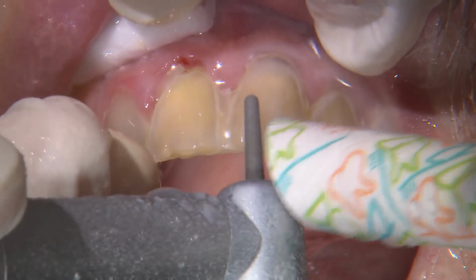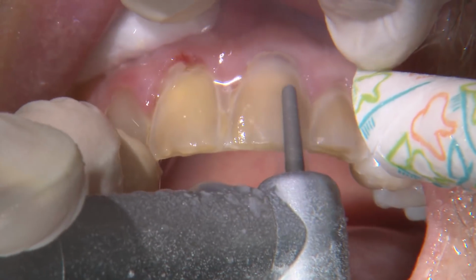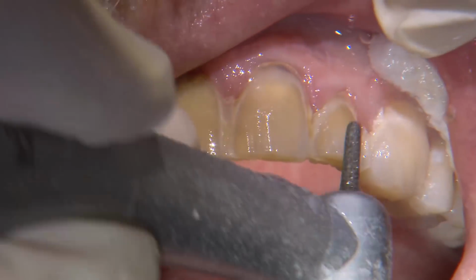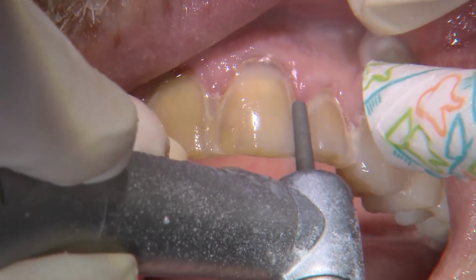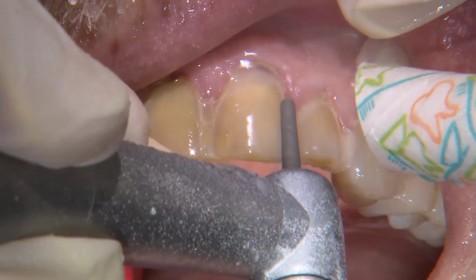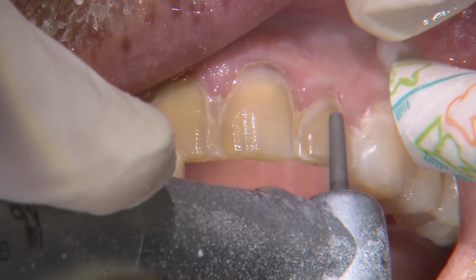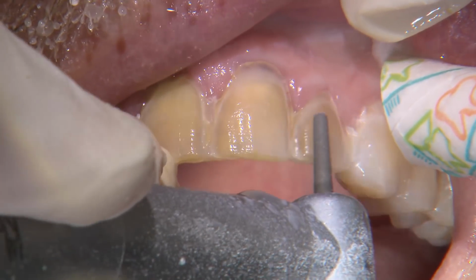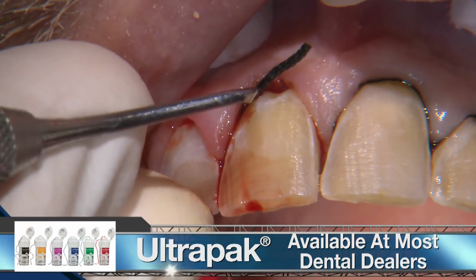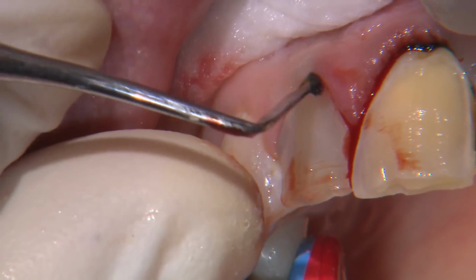Starting with a coarse grit round-ended tapered diamond, I first place vertical depth cuts through the old composites until I reach tooth structure. Since the teeth are in a good alignment with the labial surfaces near where we plan on restoring to, the goal is to achieve an even amount of reduction along 7 through 10. I'm aiming for 0.5 millimeter chamfer at the margins and increasing that reduction to about 0.8 millimeters along the middle and incisal thirds. Once the old restorations are removed, I place a 000 cord down in the sulcus to help push the gingival margins out of the way.